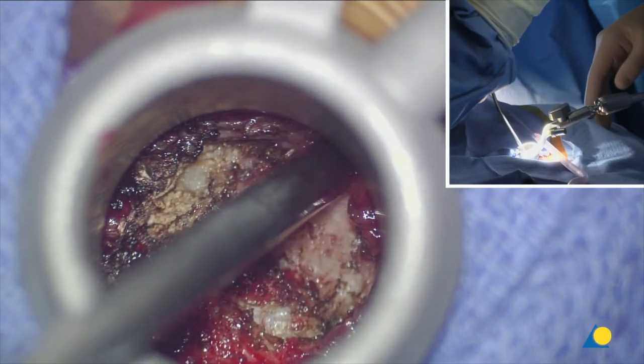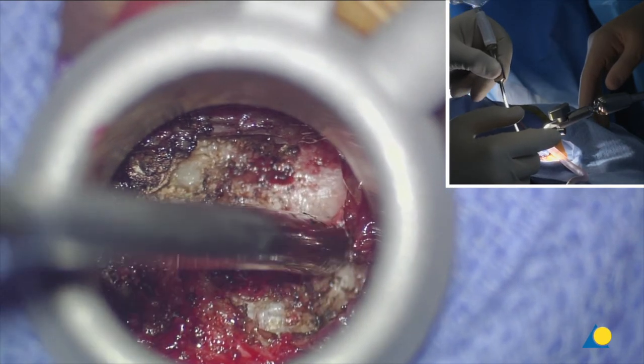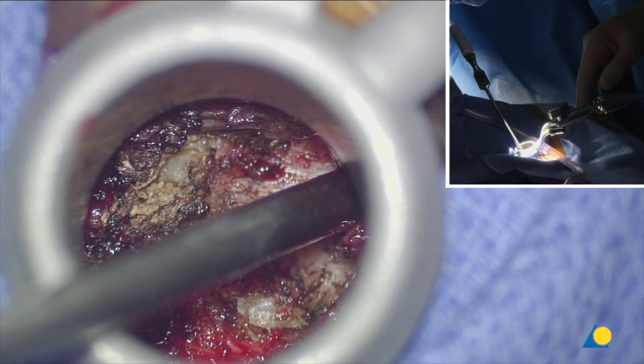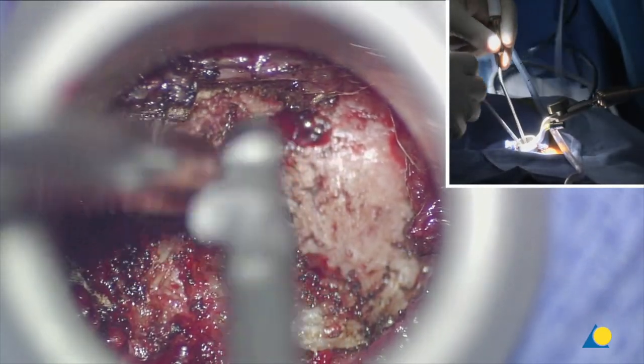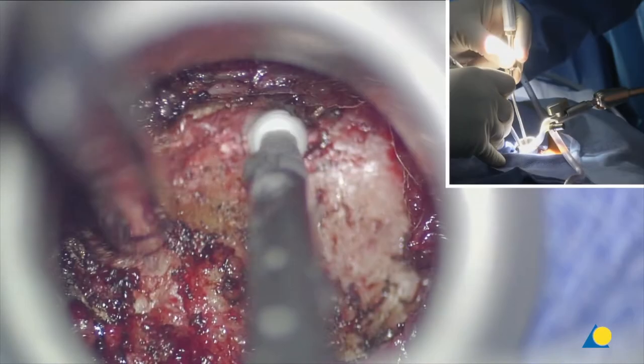That's the base of the spinous process — the L4 lamina on the right side, the inferior edge of the L4 lamina. I'm going to start drilling right there at the inferior edge of the L4 lamina. I start with the tip of the drill on the soft tissue and drill with the side.